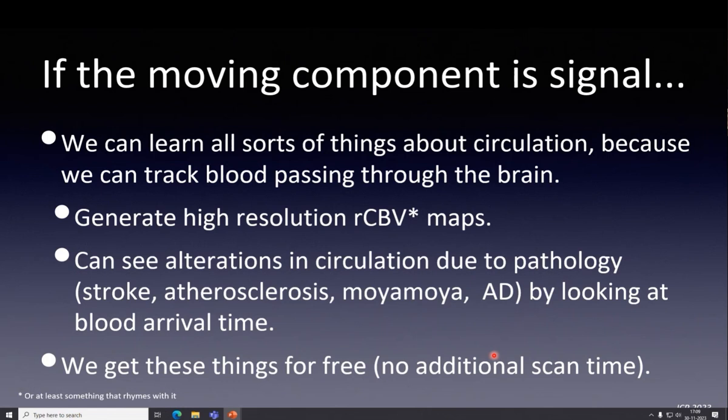So anyway, if you could do this with the resting state scan alone, this simple scan, you get this for free. You don't have to do ASL. You don't have to add time to your exam. You don't have to have a special technique, and you can use data that you already have.